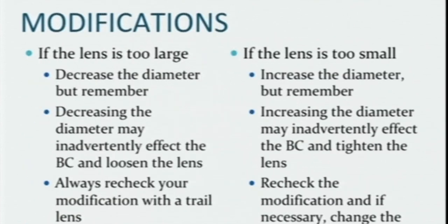How do you modify? If it is too large, decrease the diameter. But remember, decreasing the diameter may inadvertently affect the base curve. And recheck your modification with a trial lens. You should have a trial fit ready.